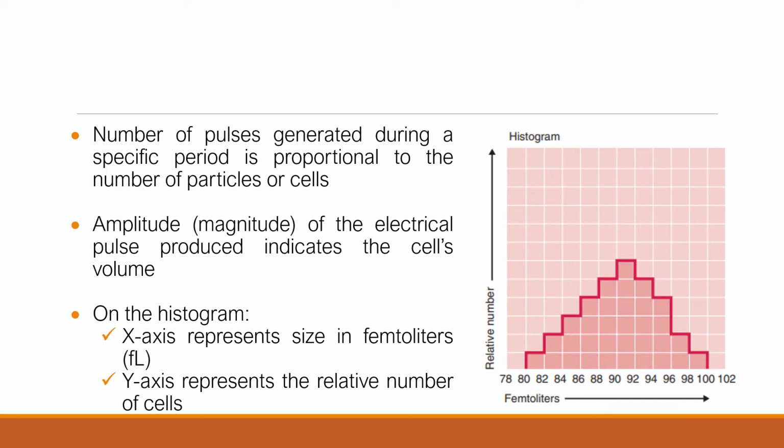Blood cell histograms are produced by the modern automated hematology analyzers which are routinely used to count blood cells. When properly interpreted, this histogram provides information on more hematological conditions than mere cell counts, helping to narrow down the differential diagnosis at a very early stage. Histogram interpretation needs careful analysis of red blood cell, WBC, and platelet distribution curves. So basically, the histogram gives us information on two important things, and those are the cell size and the number of cells counted by the machine.